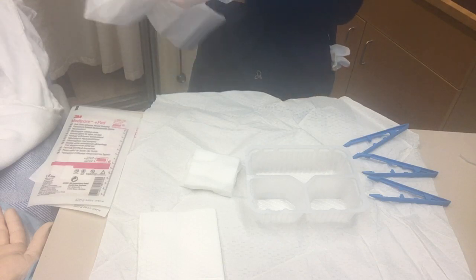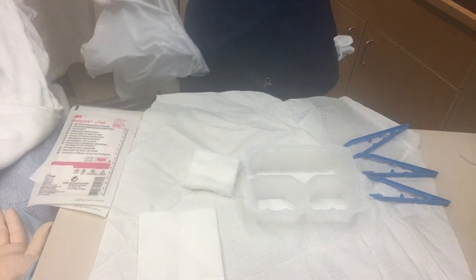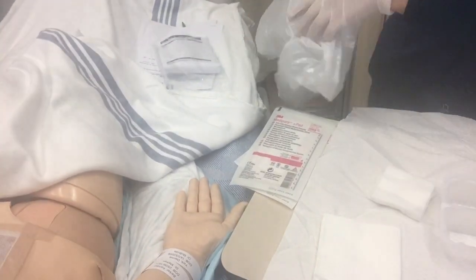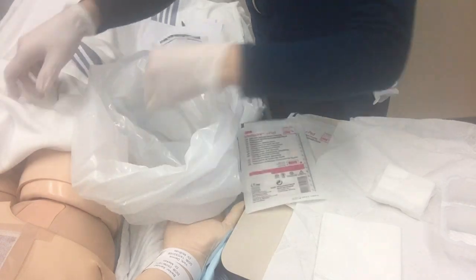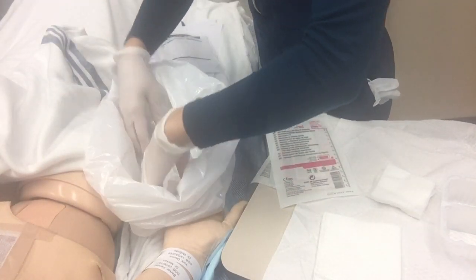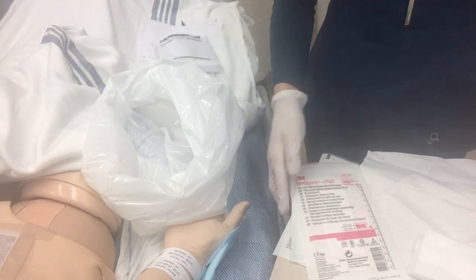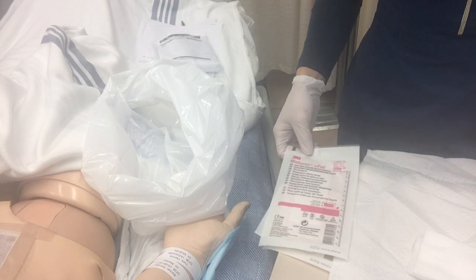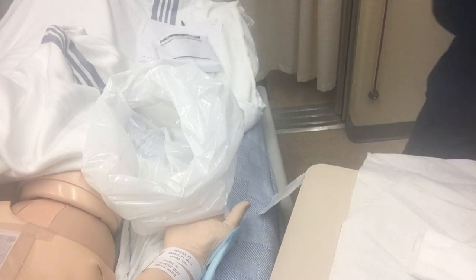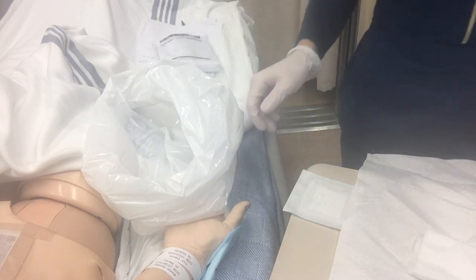I'm going to ask Kendall if it's okay if I just put the garbage bag right next to her wound so we have easy access to it. Just going to put that right there, Kendall. Okay. I don't think I'm going to need extra.